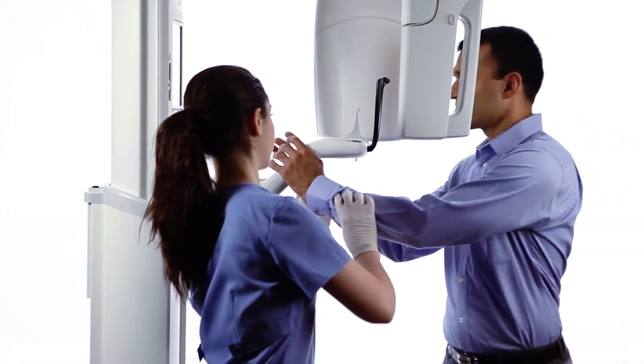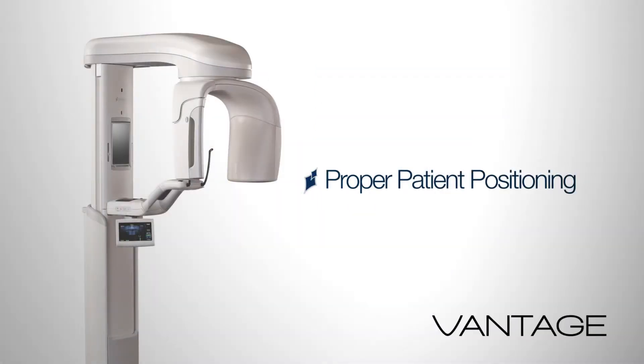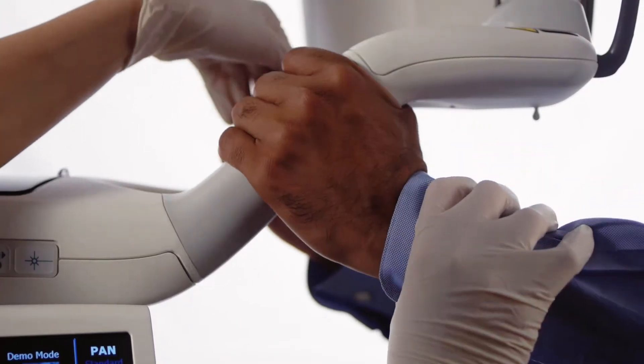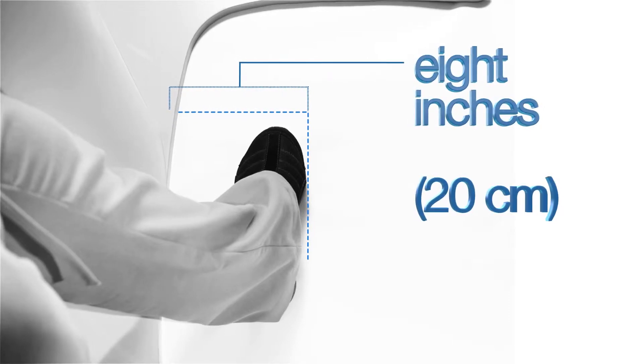Inform the patient to stand at full height and draw the patient into the structure. Begin patient positioning. Instruct the patient to place their hands on the stabilizing grips. Gently guide the patient towards the vertical column. Instruct the patient to bring the toes in contact with your instep, which will be placed approximately 8 inches in front of the vertical column.